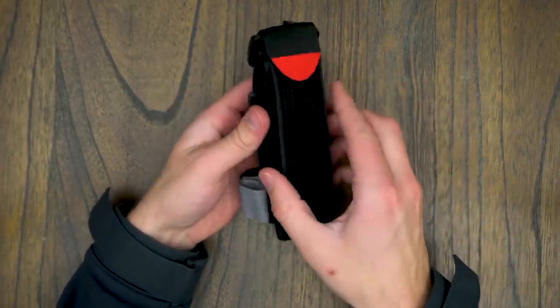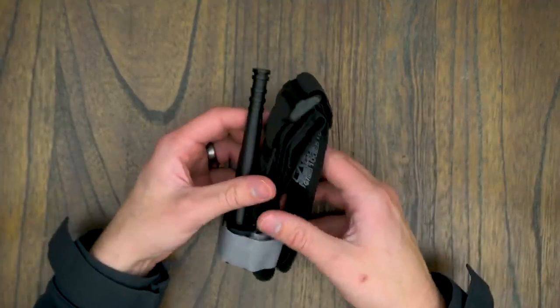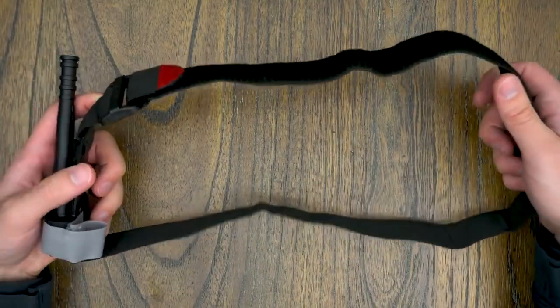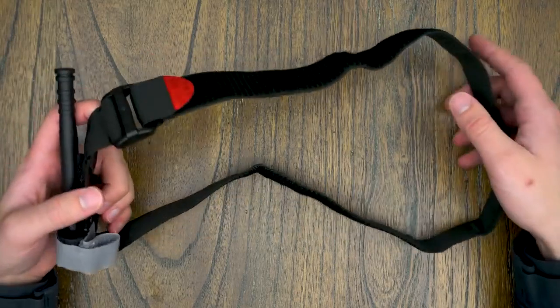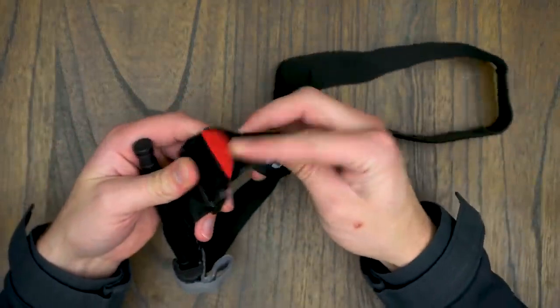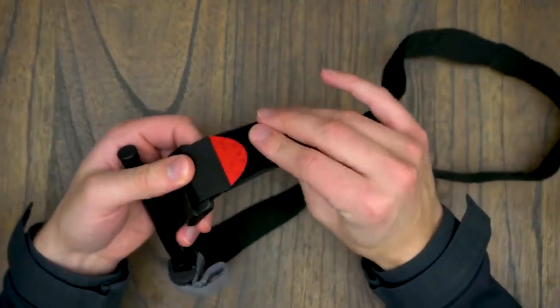Now this offers a couple advantages to the first version I showed you. For one, this is already a lot bigger. So if you need to put this around a really big leg, you can open this up quite a lot more. The second thing this allows you to have is you don't have much Velcro attaching this.